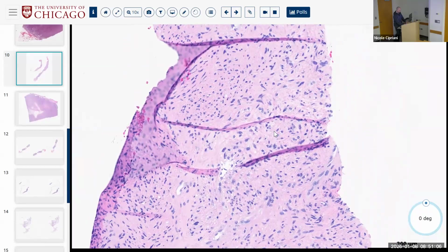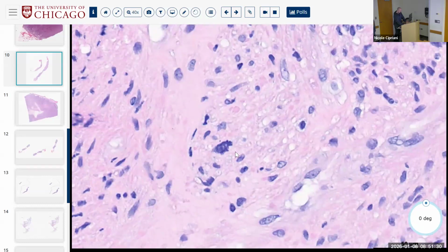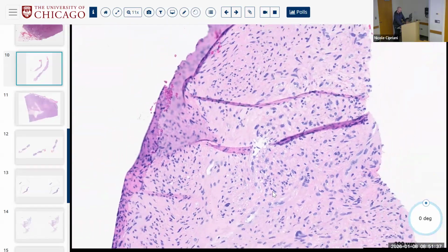Are we thinking specifically that this is a perivascular myoid tumor, or are the vessels incidental to the tumor? What I would ask, right? So if the vessels are incidental to the tumor, then what are we expanding our differential to? To all the smooth muscle stuff, exactly. Is that a mitotic figure right there? Did you just land on one? Right here? Yeah, I think so. It's a little blurry, but it's got little fingers. All right, so perivascular myoid or just true smooth muscle.